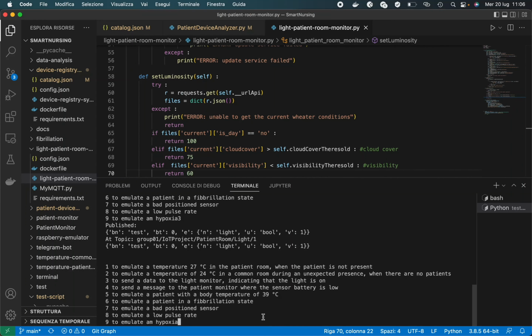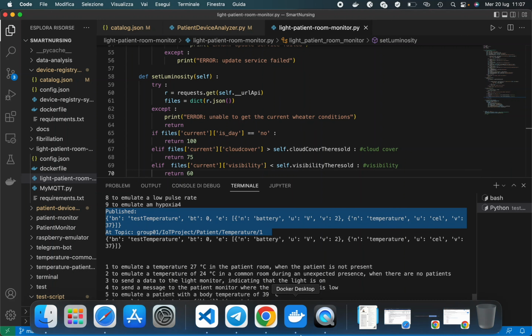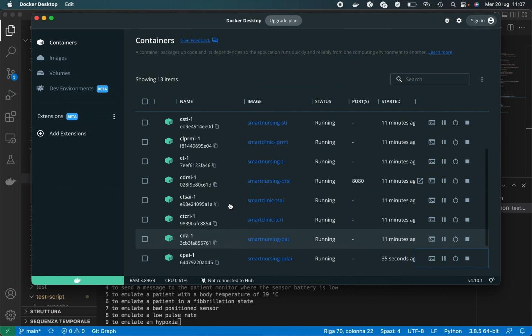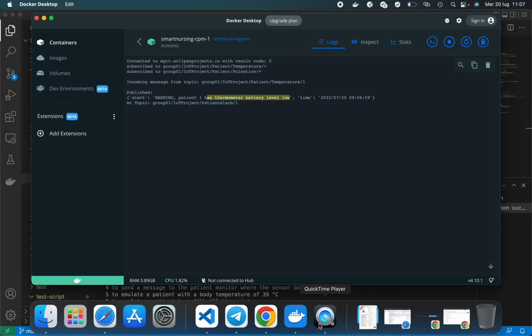I can see the data received by the microservices through Postman. Now, pressing 4, I will start emulating data for a patient with the ID 1. First, I emulate a sensor with a low battery level in order to receive the alert on Telegram. Let's first check the output of the container. In particular, the alert is sent since the current battery level is under a certain threshold set by us. Opening Telegram, I can see the notification.